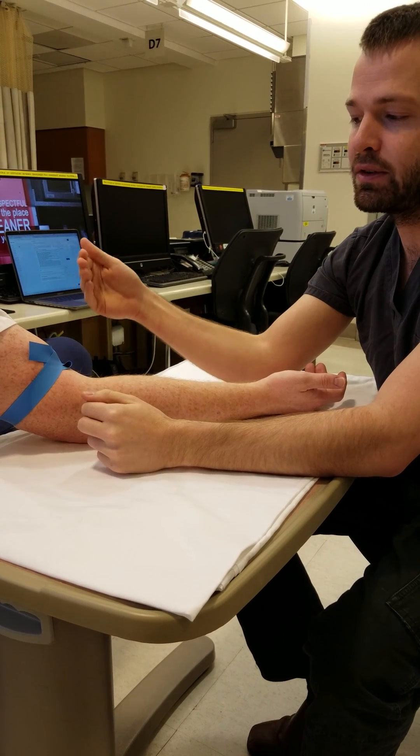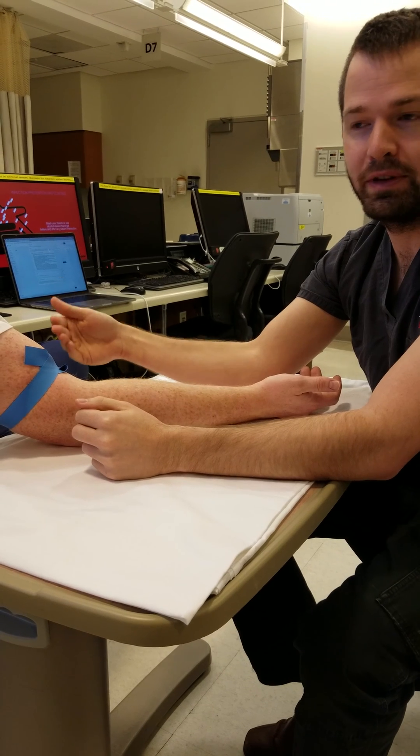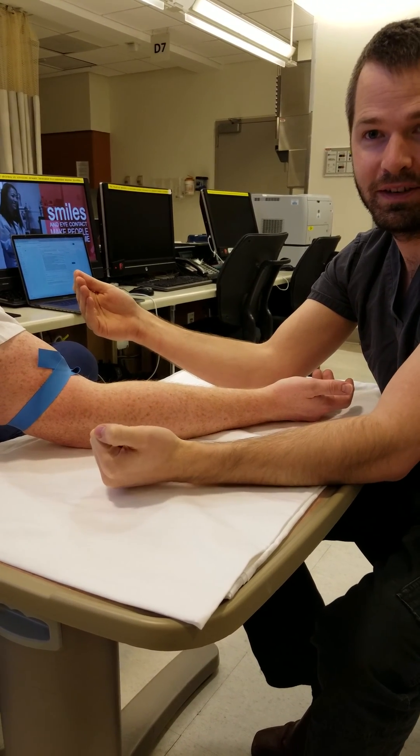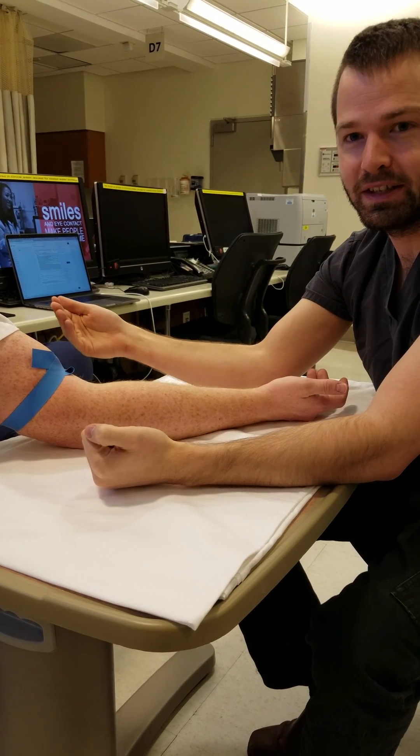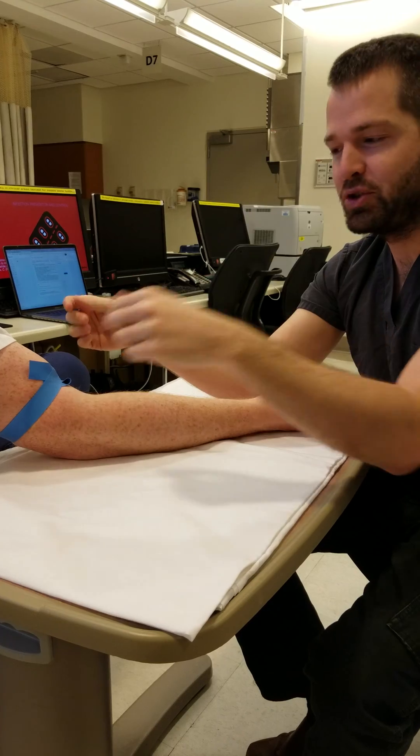You don't have to pull this all that tight to compress a vein. If you need to prove to yourself that you don't need this much pressure to compress a vein, find a vein on yourself and push down. You don't feel a lot of resistance as you completely collapse the vein. So let's zoom in and I'll show this again.